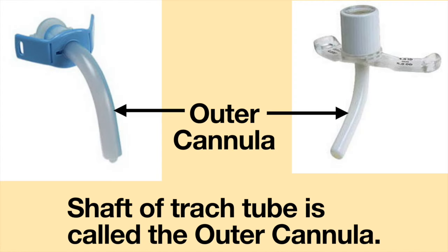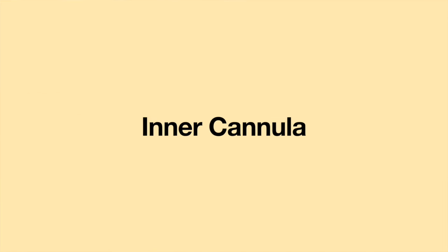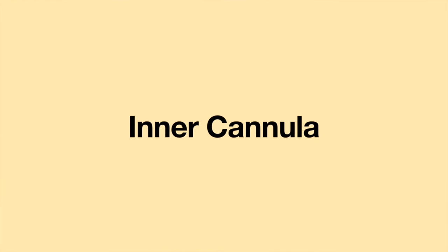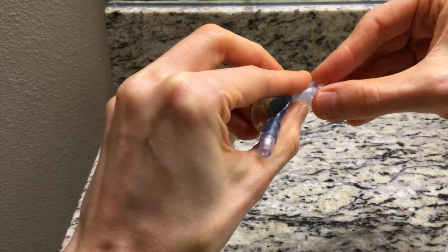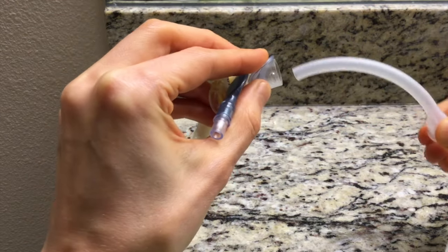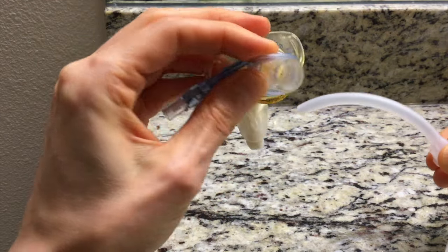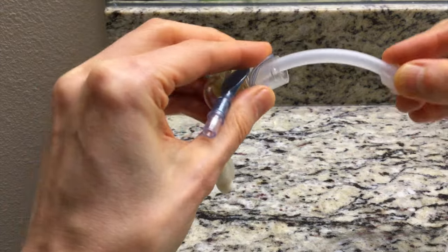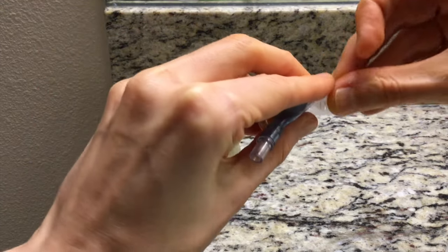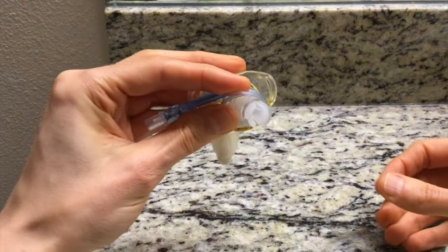The shaft of the tracheostomy tube is called the outer cannula. Some tracheostomy tubes have a removable insert which is called the inner cannula. The inner cannula fits into the outer cannula.